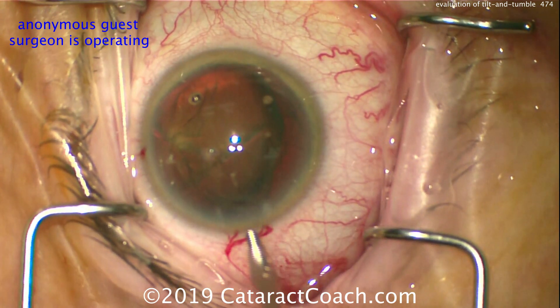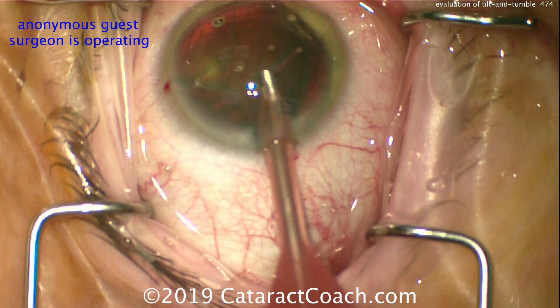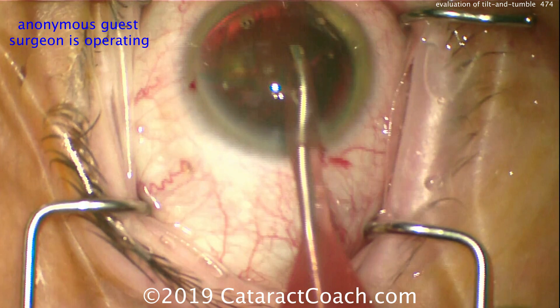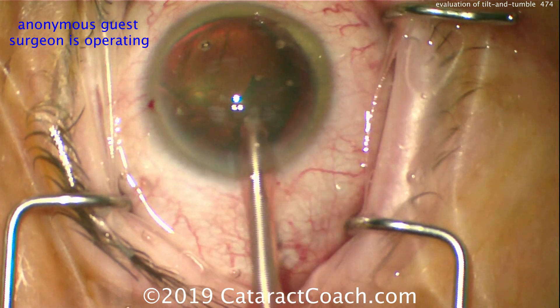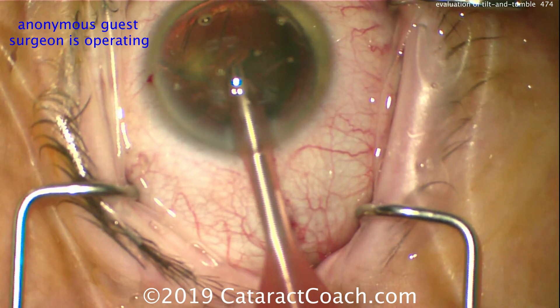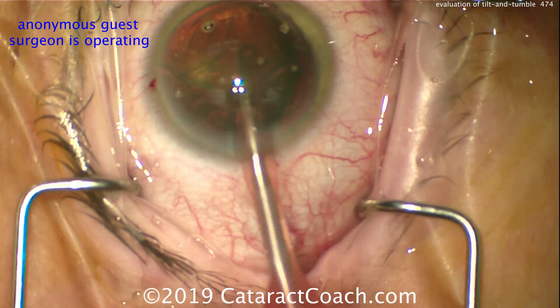For tilt and tumble, you definitely want a high flow and a high vacuum — at least 30 to 35 cc's a minute, maybe even 40 cc's a minute. And a vacuum of at least 300 mmHg; even 400 to 500 would be better. The idea is that the part of the nucleus tilted out of the capsular bag can simply be emulsified using the FACO probe at this high vacuum.